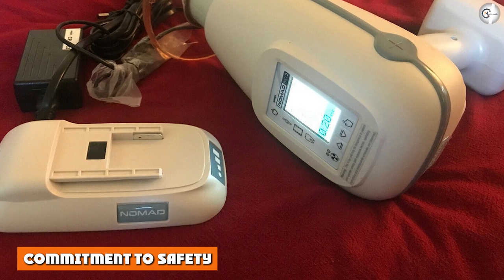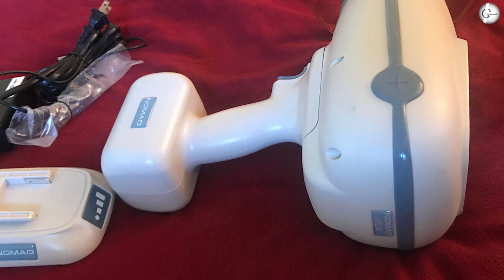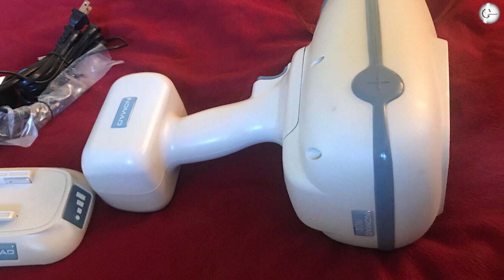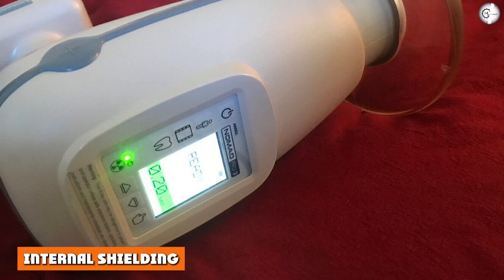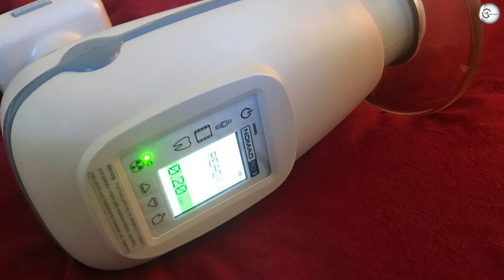Commitment to safety. We understand that safety is paramount when clinicians treat their patients. To keep operators safe, the Nomad Pro 2 has two highly devised shielding features. Internal shielding: due to its innovative internal shielding, the Nomad Pro 2 is safe for the operator to use as a handheld device.